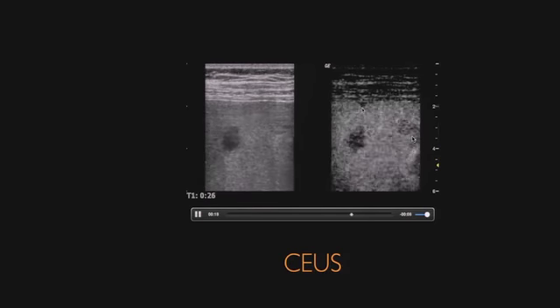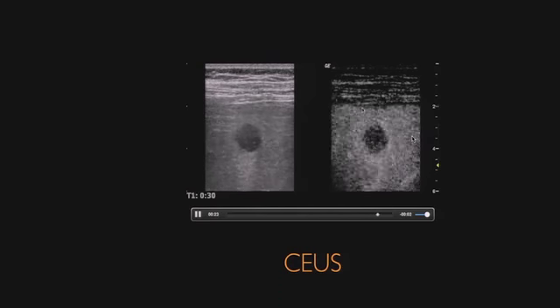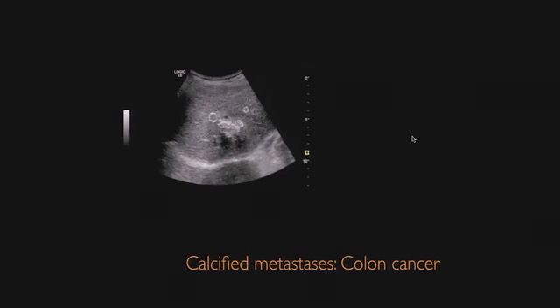Okay, and it's, of course, washing out quickly. Calcifications are also a clear finding on grayscale ultrasound, but as soon as there's a history of malignant tumor, you should perform a contrast study, because these calcifications are calcifications of the tumor.